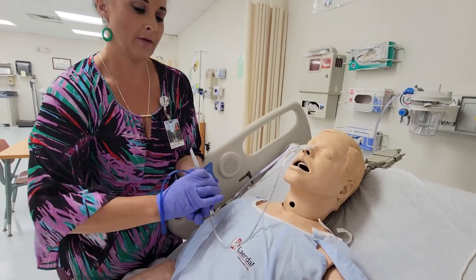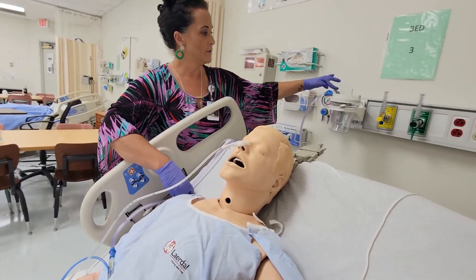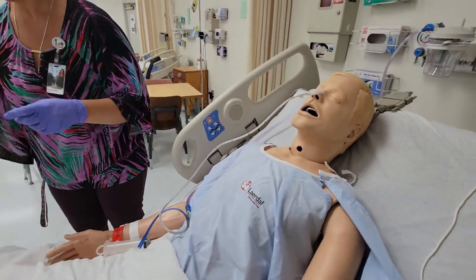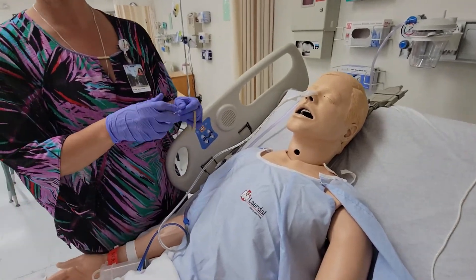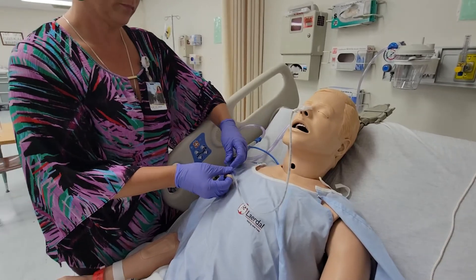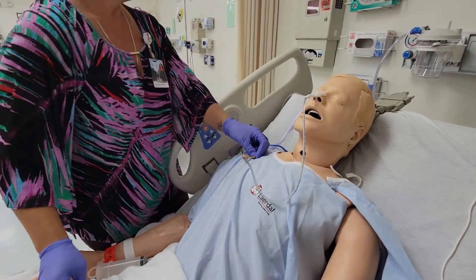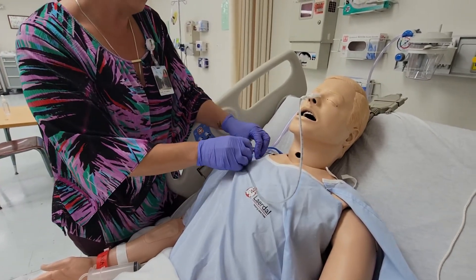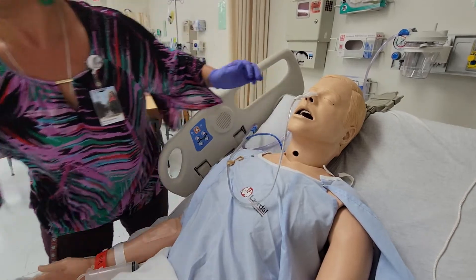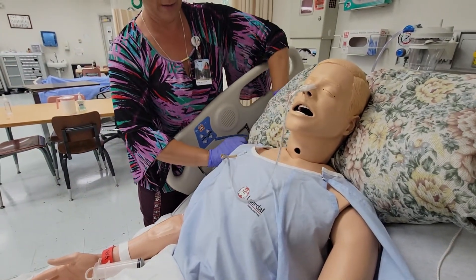I'll put my adapter here, I've got it crimped off, and I'll connect it to my tubing — push it on there real good. I'll turn it on to intermittent suction. We don't need the water anymore. This is where the rubber band comes in — we want to give them enough slack to turn their heads but make sure it's not pulling on their nose. Take the rubber band, loop it through itself, and pin it to their gown. See how he has enough room to turn his head and it's not pulling. Put the pillow back and tuck the tube behind it.